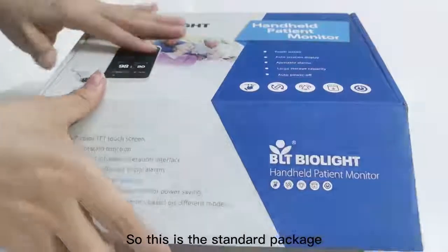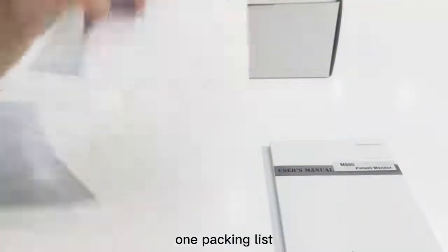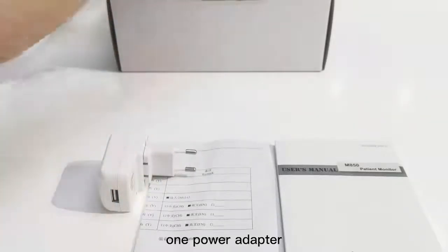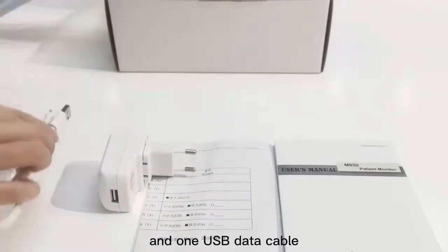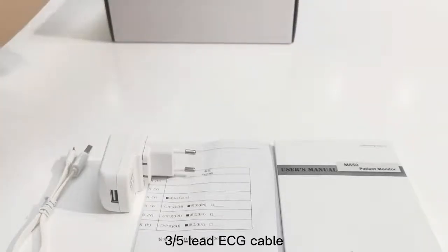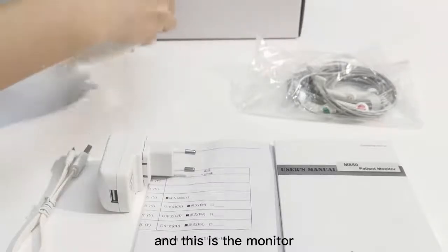This is the standard package. In the package, there's one user's manual, one packing list, one power adapter, one USB data cable, three or five lead ECG cable, and this is the monitor.